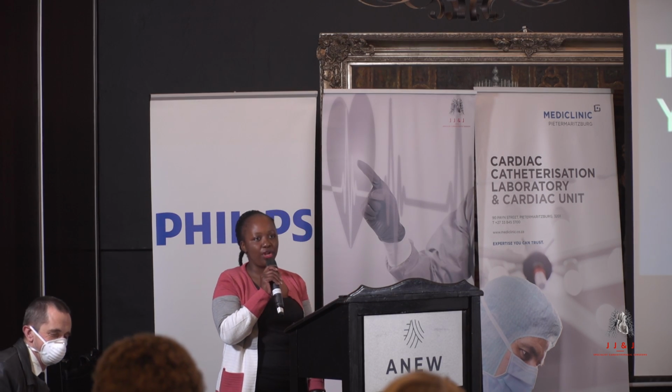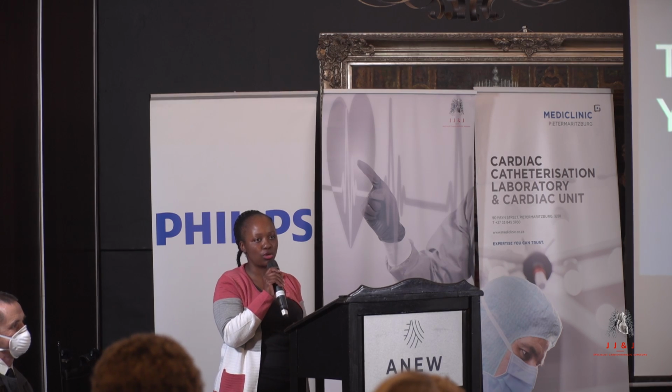In a nutshell, when we nurse patients in the ICU, we don't just look at a patient with one finding, whether it's your blood pressure or your pulse, but you look at the patient holistically. You look at your cardiac output monitor, you look at your hemodynamic monitoring, which is your CVP, your arterial line, and you manage the patient holistically, not with just one number. Or you can end up with hypervolemia or hypovolemia if you mismanage your patient. Hence, you do not optimize oxygenation and you do not optimize cardiac output.